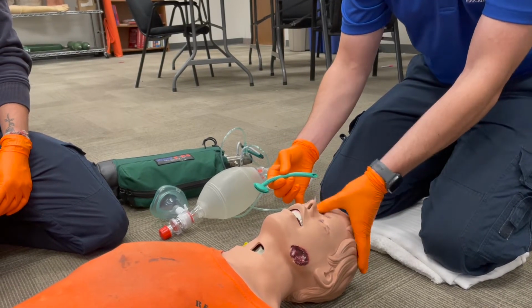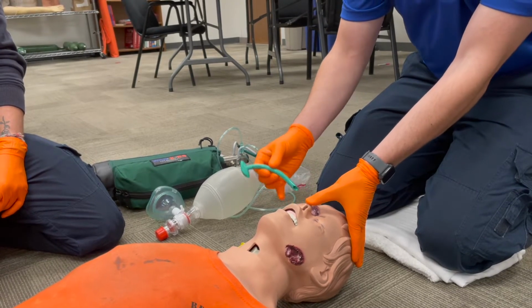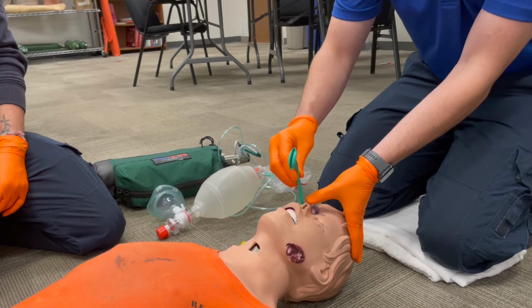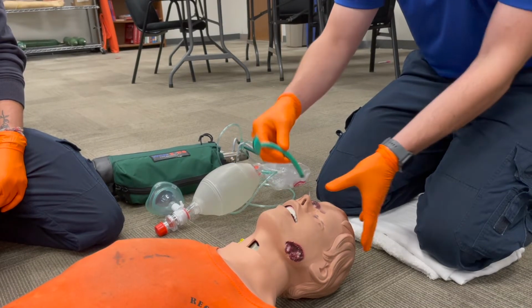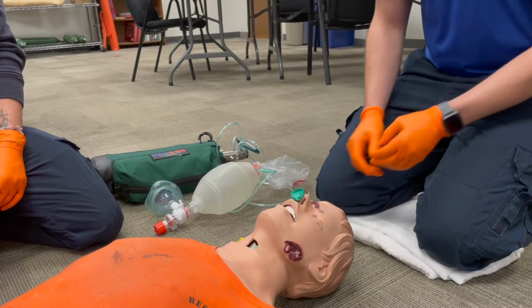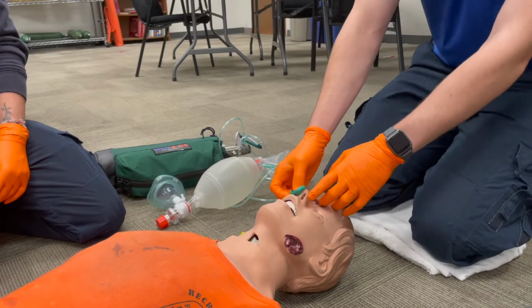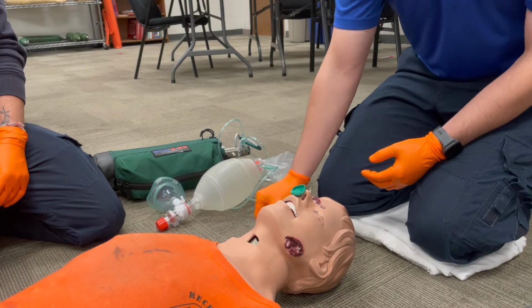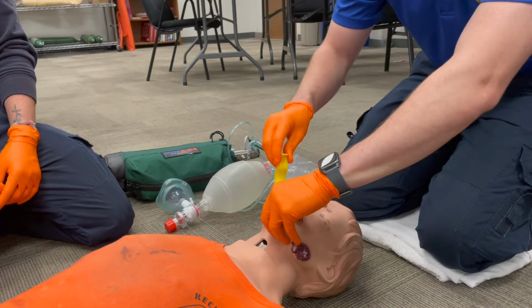It may also make it easier to insert if you kind of push down on the tip of the patient's nose and kind of scrunch it up like a pig's nose. And that kind of straightens out your path. Also important to know, you're not inserting up, you're inserting straight back. So just like that. Also, there's nothing wrong with inserting two nasopharyngeal airways. So you can do one in each nostril. And then also, in addition, you can have the oropharyngeal airway in. So technically 3 airway adjuncts can be placed all together.